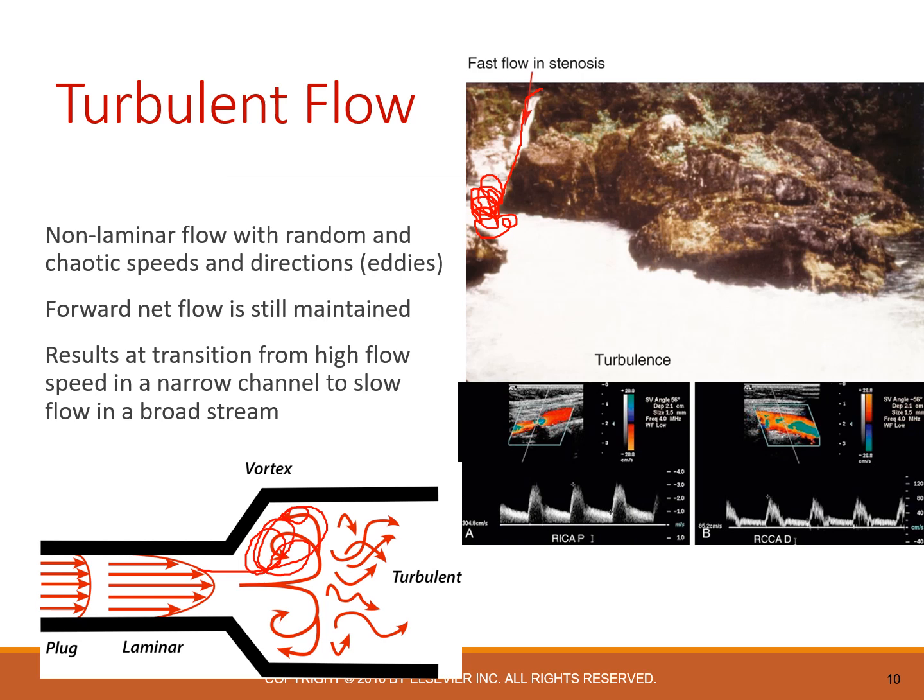And so that's when we see turbulence. We often see this turbulence. We're going to be identifying it on our arterial side post-stenosis. So if we had a big narrowing stenosis like you can see in here, this narrowed area, and then it gets released out into a larger area, you're going to see turbulence occur right in this space.